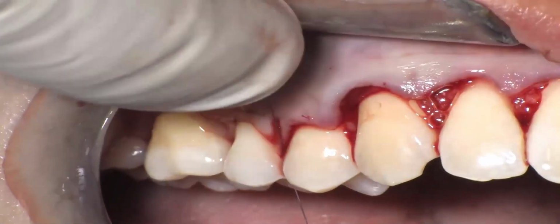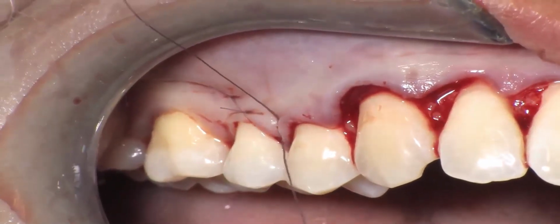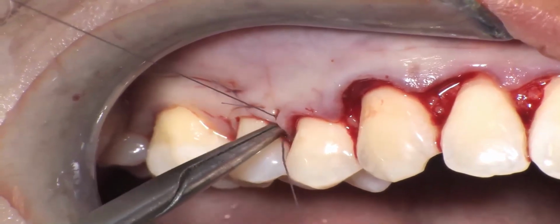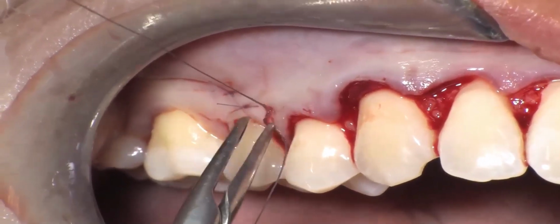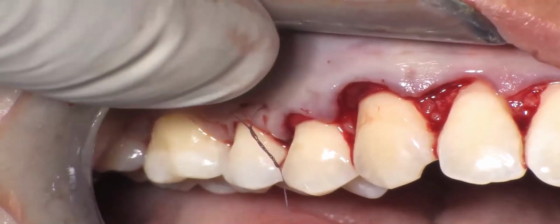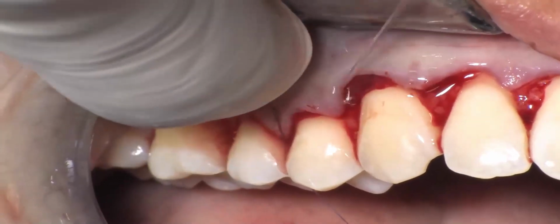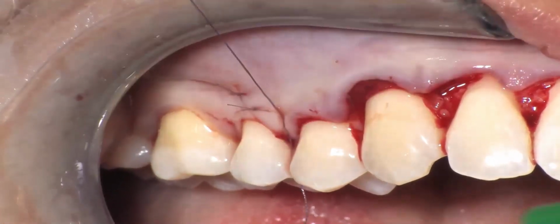And make a compression exactly in the middle. Surgical anatomic papilla. I don't like too much. Right.